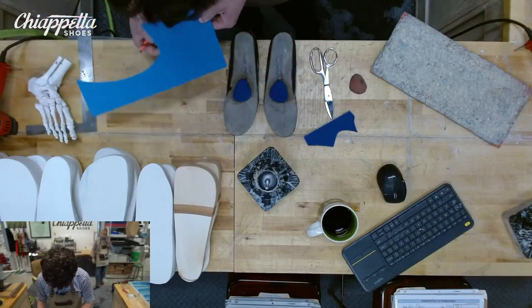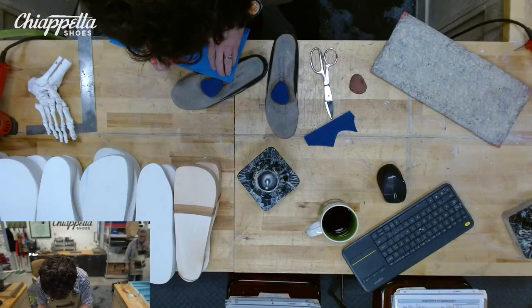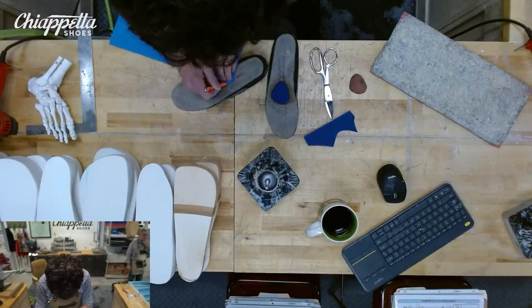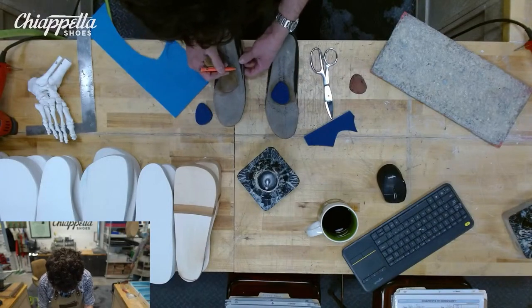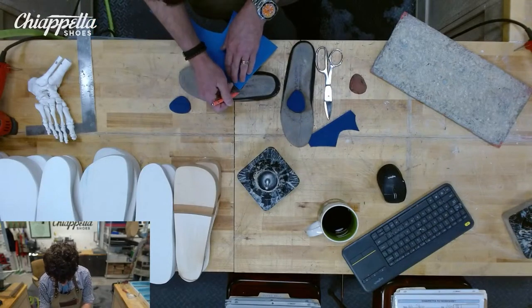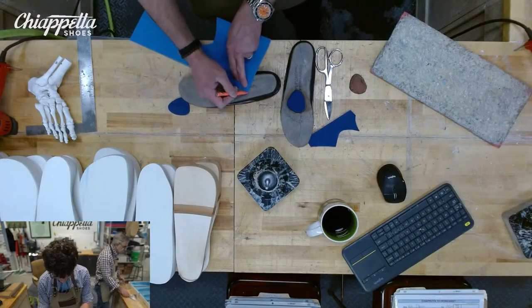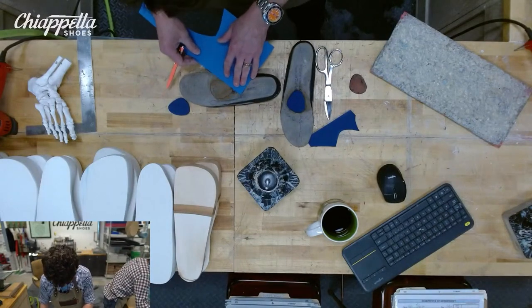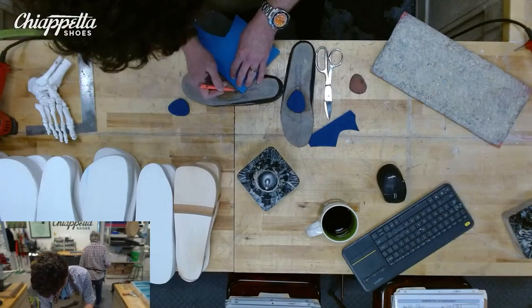Now, when we're doing a scaphoid pad, a little extra arch, you can take that from 3 different places. You have the 5th met base, so right there. A standard scaphoid pad is right off that 5th met base. If you want more rear foot control, you can go behind there and angle it farther back. If you want more forefoot control, you can do it farther forward. Standard is right off that 5th met base. Not sure if you knew that, but now you do. The more you know, Pete, right?